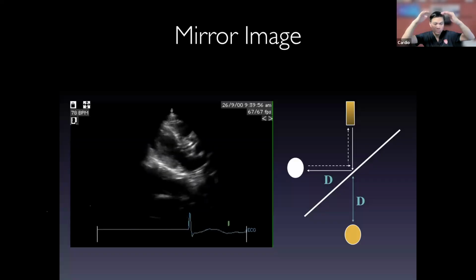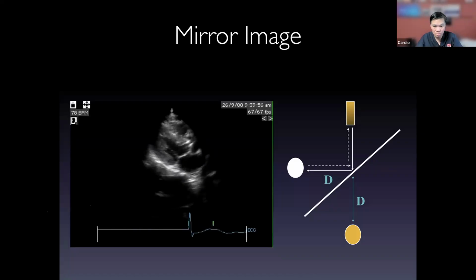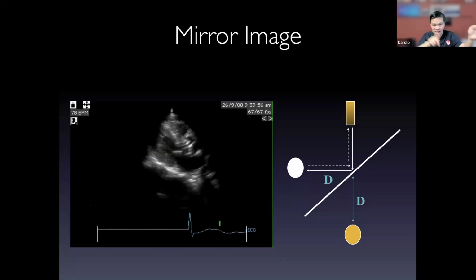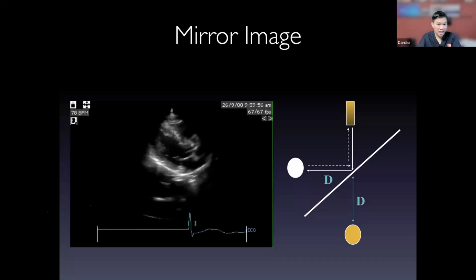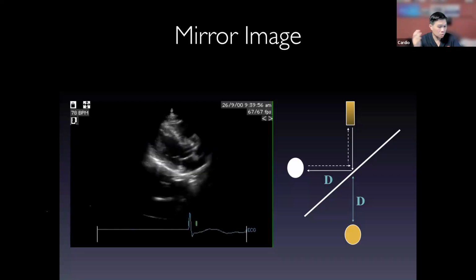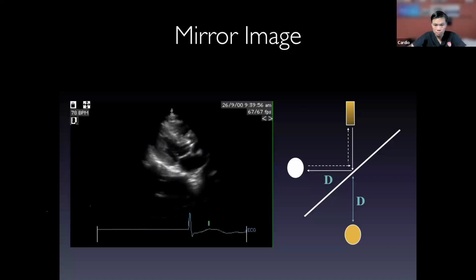That's why it can actually reflect the images. If the particles are rougher, for example, like a drywall or stucco wall, where light comes in and keeps bouncing all over the place, then you can't see your face when you're looking at the stucco wall. But when you have a mirror, for example, a very sheen plastic or your iPhone surface, then you can see because the surface particle is so small that it can reflect.